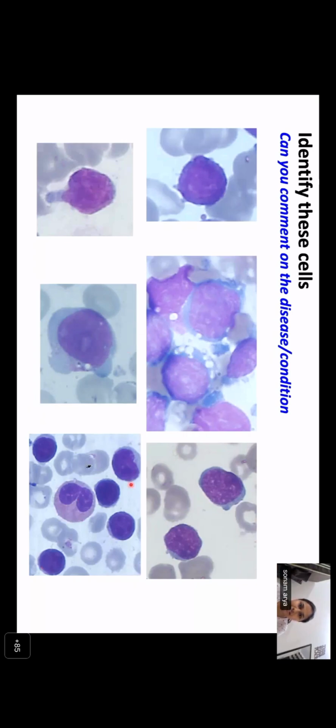And what about this case? This is the peripheral blood. What do you think about these predominant cells like this? These are erythrocyte precursors, maybe. Why do you say they're erythrocyte precursors? Anyone else think differently? What do you think, Soumya, about these cells? First, tell me, do they look like erythrocytic lineage, or do they look like lymphocytic lineage? Lymphocytic lineage. Okay, so yes, I agree with you.